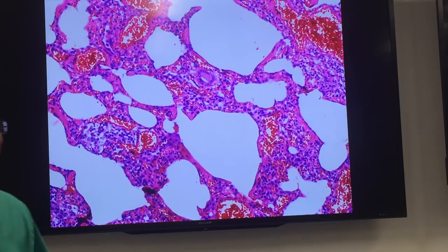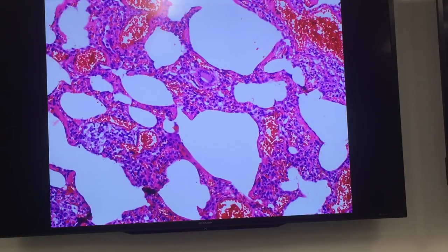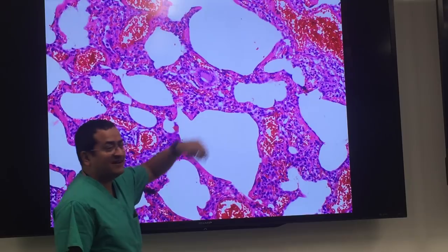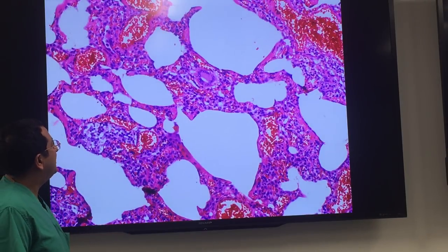All right, let's make it like this. First years describe, everybody else gives a diagnosis. Okay, let's make it like this. Expansion of the interstitium. Like see here? Yes. And I see a giant, a multinucleated giant cell. Yes, what's that in there? In the multinucleated giant cell, what does it look like?